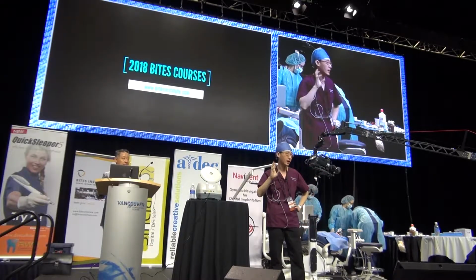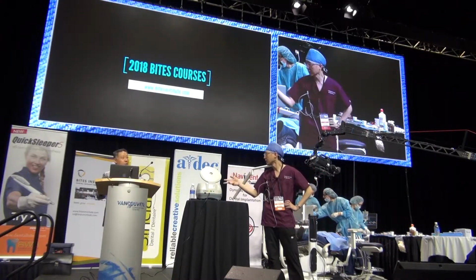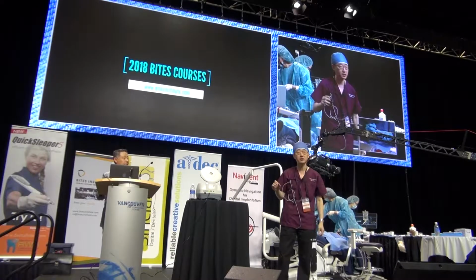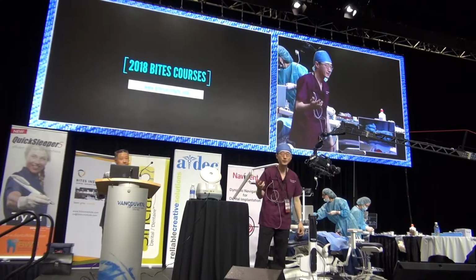the stability, and I got the stability, and luckily Penguin told me, right? I had about 66 and then 70 something, okay? Now, by no means is it the best stability, it's not, okay? Because if the patient goes and cracks a crab, next day it could break, okay?